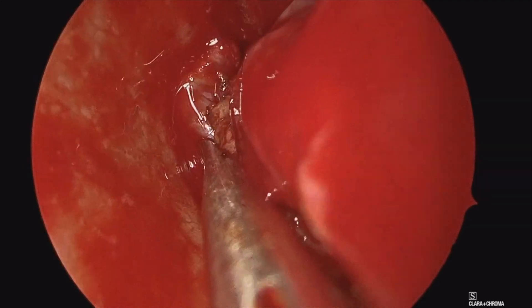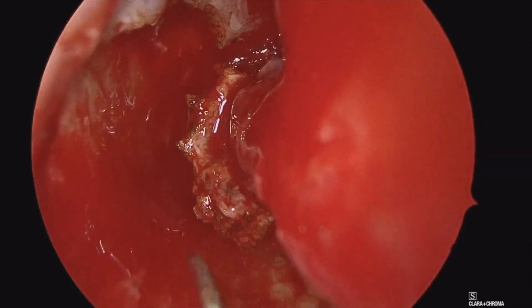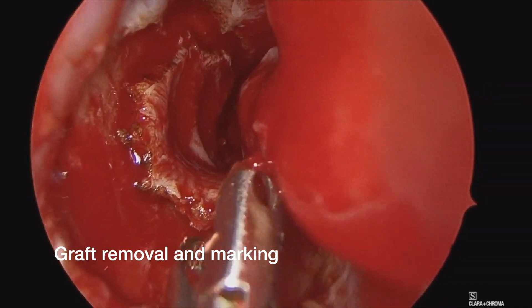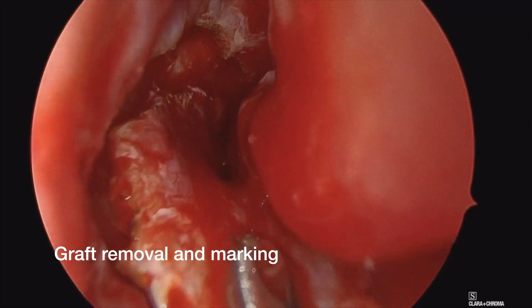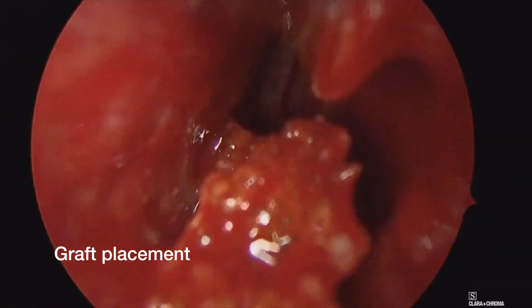Once most of the edges are released, then it's fairly straightforward to go and elevate this towards the posterior aspect. What you'll see coming in here is a pediatric Blakesley forceps. We'll use that to grasp the anterior part of this. We want to make sure we keep this oriented properly from the mucosal side versus the periosteal side.